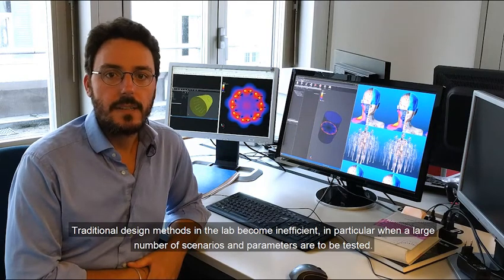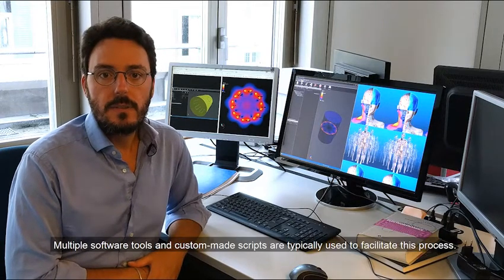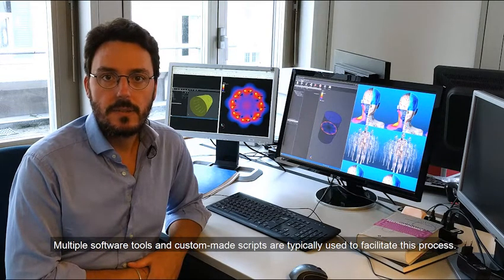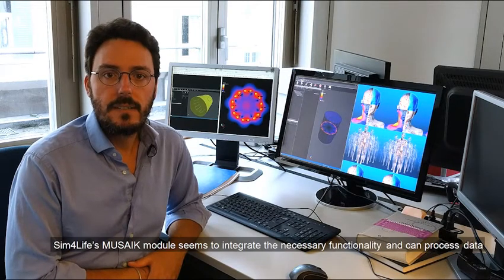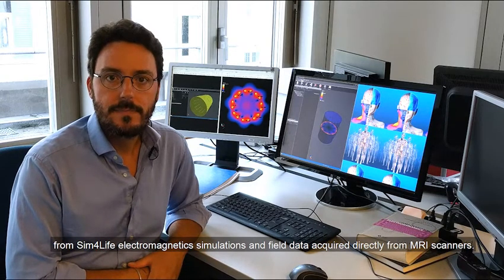Traditional design methods in the lab become inefficient, in particular when a large number of scenarios and parameters are to be tested. Multiple software tools and custom-made scripts are typically used to facilitate this process. This generates a lot of overhead work in terms of data formats, compatibility, and validation. Sim4Life's Musaik module seems to integrate the necessary functionality and can process data from Sim4Life electromagnetic simulations and field data acquired directly from MRI scanners.